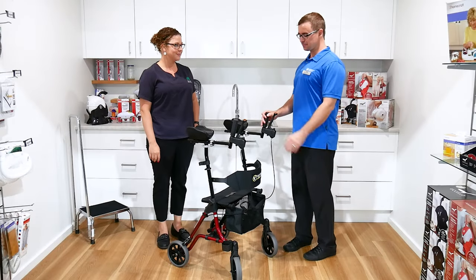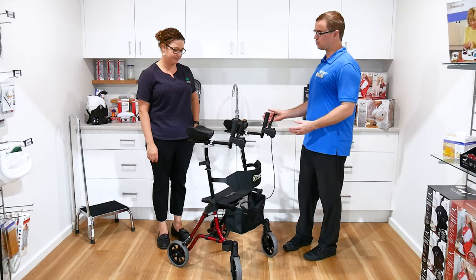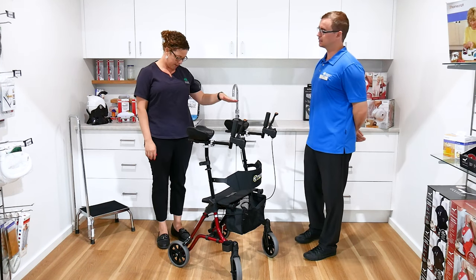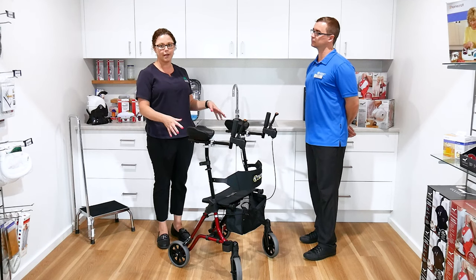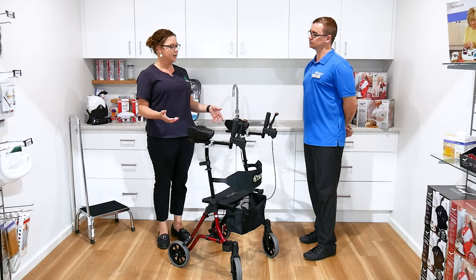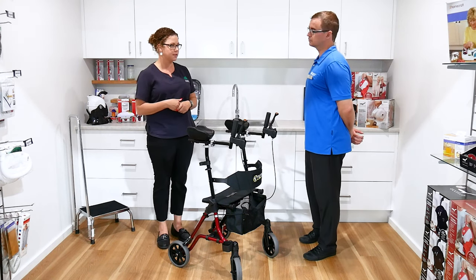We're at Anstie's today. I'm here with Bec and we've got ourselves a forearm support frame in front of us. What model is this? This is the Peak Care Tei mower. So this is in the small version. We can also get this in a tall version, which will obviously be a little bit taller, and the seat height will be raised as well.